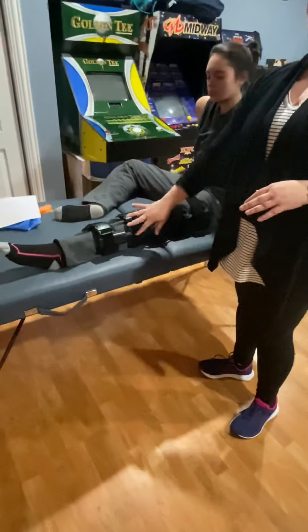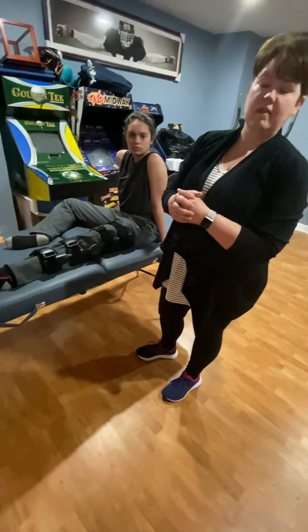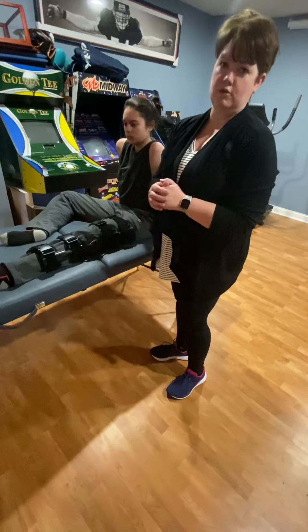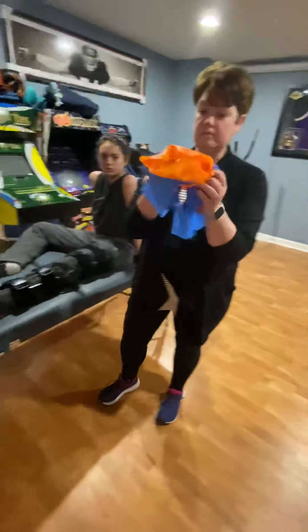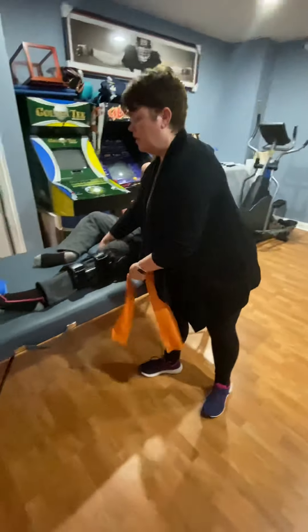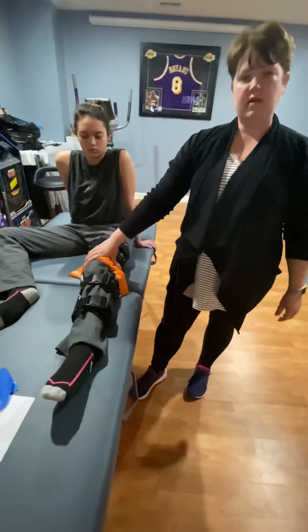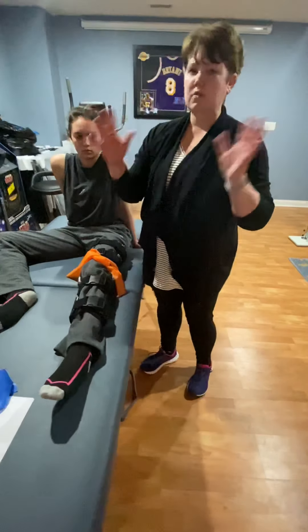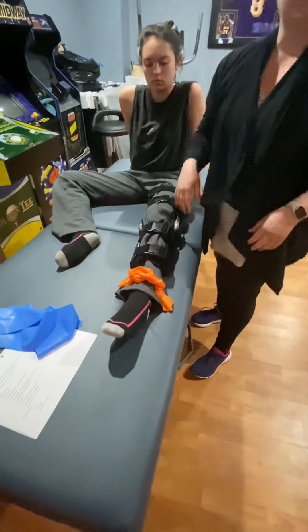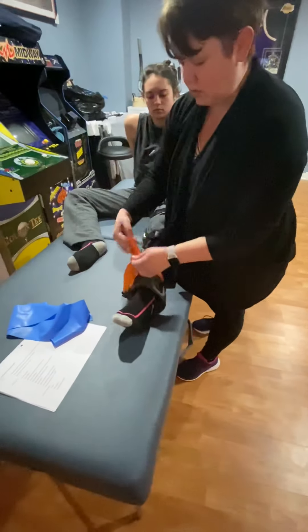We are allowed to take this brace off for therapy, or you could just unlock it for therapy if you wanted to do heel slides or hamstring curls or anything like that. But anytime she's going to be up on her feet, anytime she's bearing weight on this leg, it is locked at zero. Now an easy way to show this for skill checks — I know you guys all brought home a piece of TheraBand. Since you don't have a brace at home, use your TheraBand kind of as your brace. When the TheraBand is up around the knee, that means the brace is on. If you're going to do some range of motion, just slide it down around the ankle — that tells me watching that the brace is off.